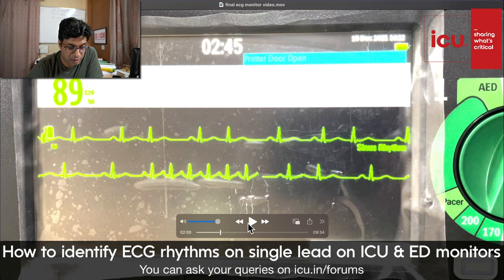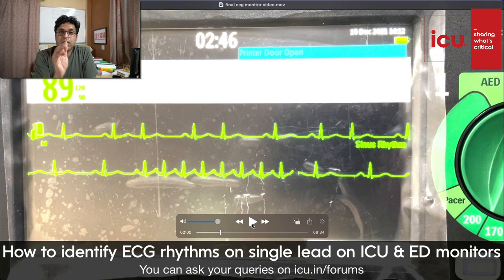Okay. Now, this has turned into a tachycardia. Anything above 100 is called tachycardia. Anything below 60 is called bradycardia. So it could be sinus bradycardia, it could be junctional bradycardia or a ventricular escape rhythm. Anything above 100, we call it tachycardia.